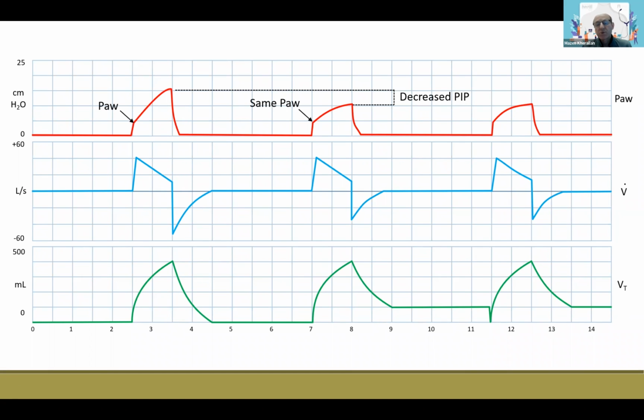And if you have a chest tube, it comes out, of course. If you don't have a chest tube yet, this is a different story. So I'm talking about air leak that is already managed. So the peak inspiratory pressure is going to be decreased because the compliance is increased. And then you can measure the inspiratory volume and the expiratory volume.